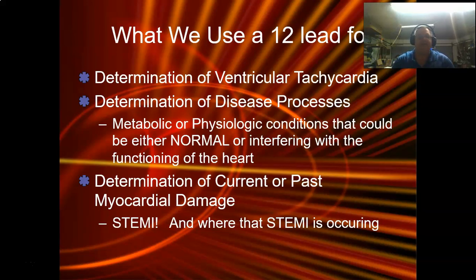One other little point, a little sidebar about the STEMI. A 12 lead will show us that the person is having a heart attack. It will not, and I have to stress this very strongly, it does not mean that the person is not having a heart attack, okay? So if you're seeing ST elevation, you can look at the patient and go, yeah, you're having a heart attack.